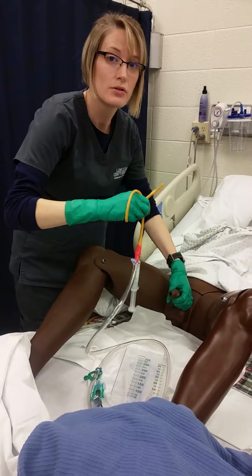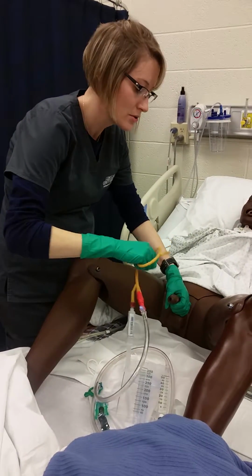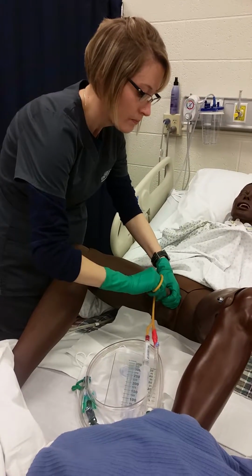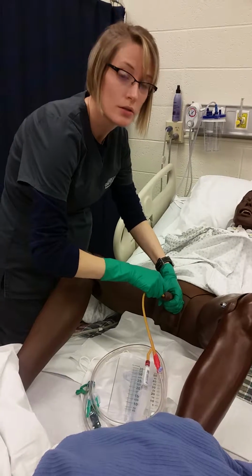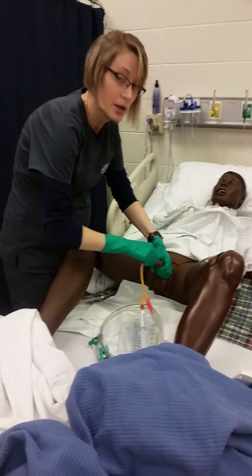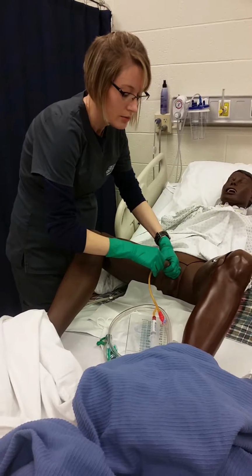So when I'm ready to insert this catheter for him, I'm going to have him take a deep breath in and out and let him know I'm getting ready to insert it. I would insert the catheter tip 7 to 9 inches for males until I see urine return, and then another 2 inches to ensure that I'm inside the bladder.